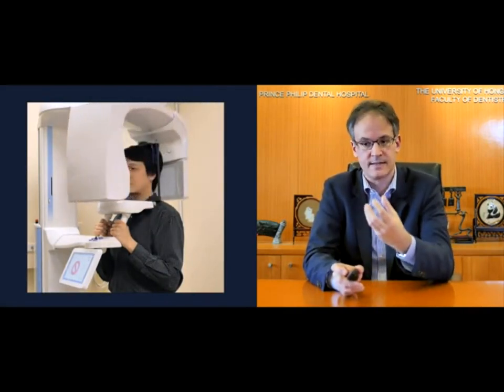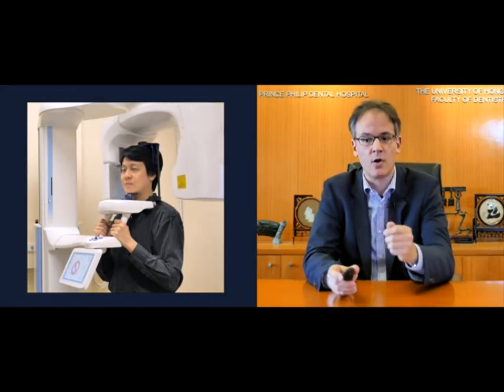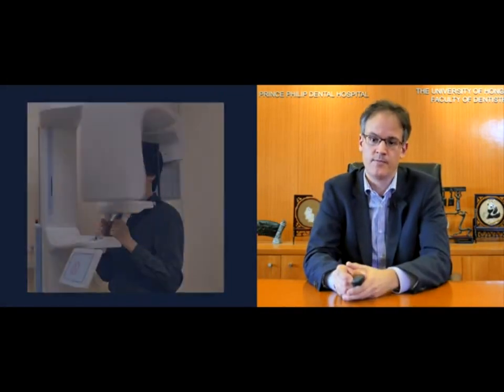During this rotation, the region of interest is fixed at the center, and the gantry is rotating around it. During this rotation, normally around 500 up to 1,000 images are taken. So a lot of images. Those are called basis images, and they will be very important later on.